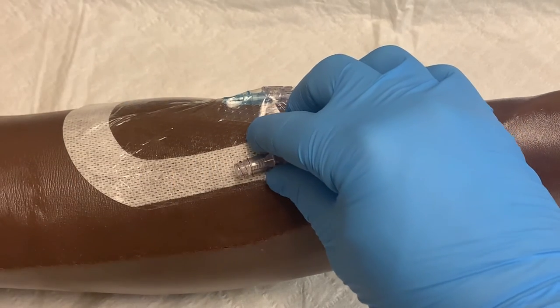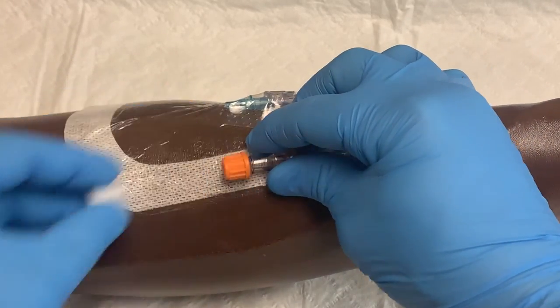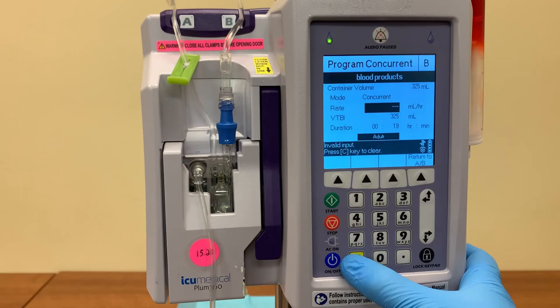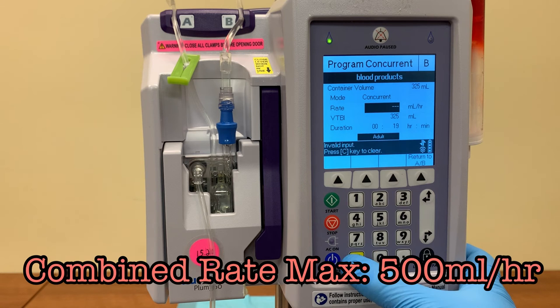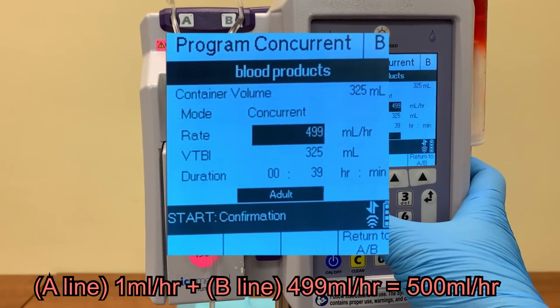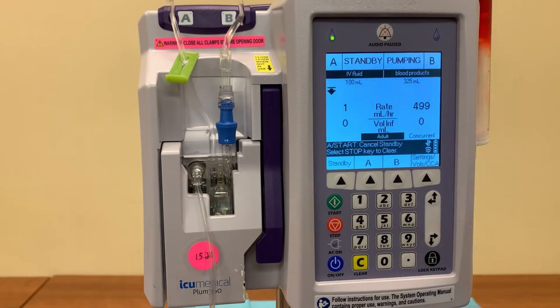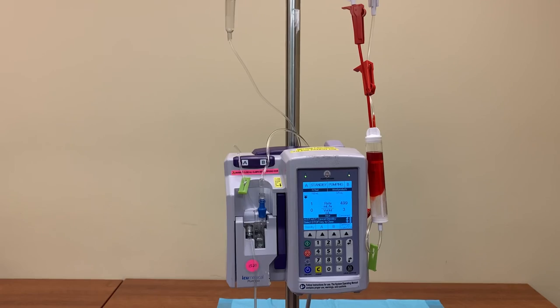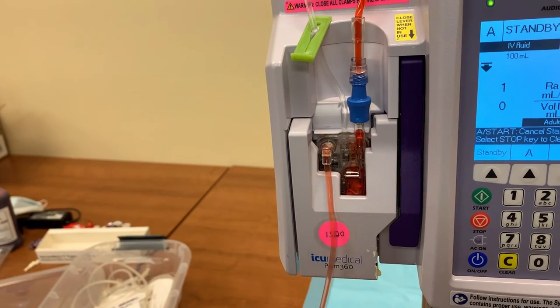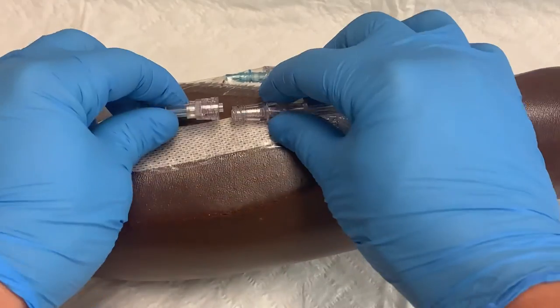You'll need to prime the entire line with blood. Make sure the IV is disconnected from the patient — cover the IV with a swab cap and then return to the pump. The combined programmed rate of the A and B lines maxes out at 500 milliliters an hour, so you can run the B line at 499 milliliters an hour, and this is the fastest way to prime the tubing. Just ensure that the line is not connected to the patient. Turn it on to this rate and let it drain into the sink as it primes. When the fluid exiting the line is red, stop the pump and reattach to the patient.